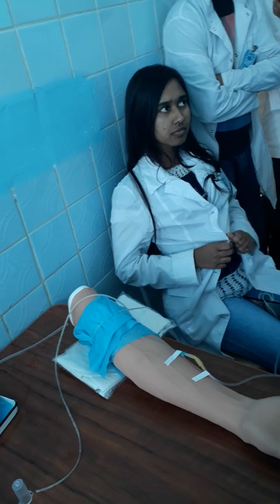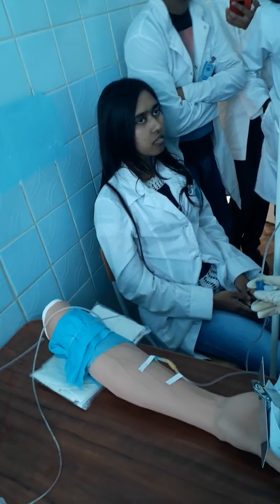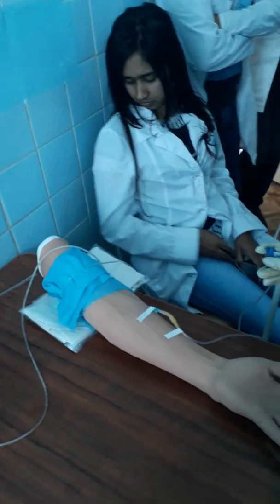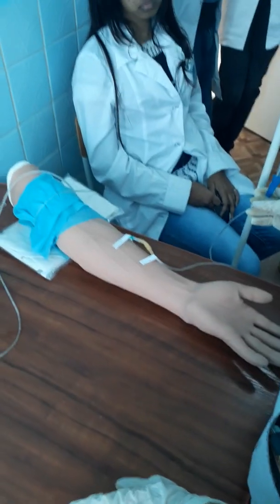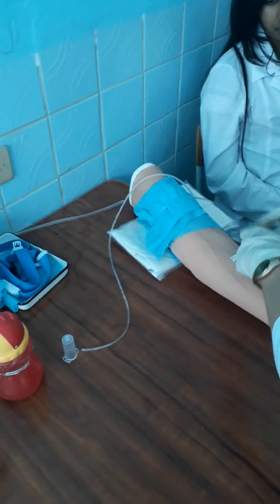How many drops in 1 milliliter? 20 drops in 1 milliliter. Your patient needs 3 milliliters, that is 60 drops. What is the speed? One drop per second. Yes, 1 drop. You can look at your watch and regulate. And after that, you close the needle with a sterile piece of gauze.